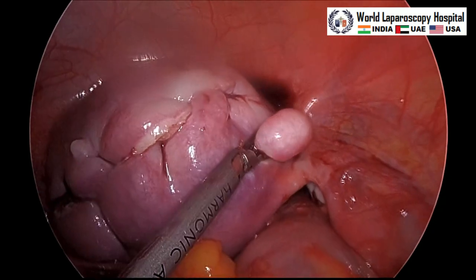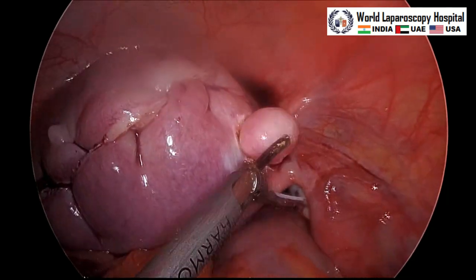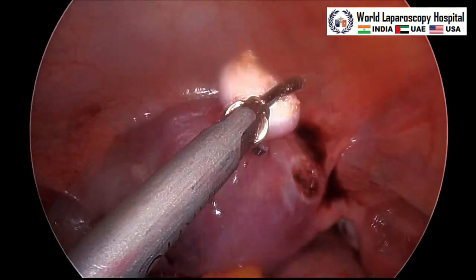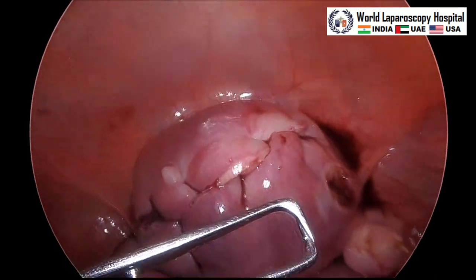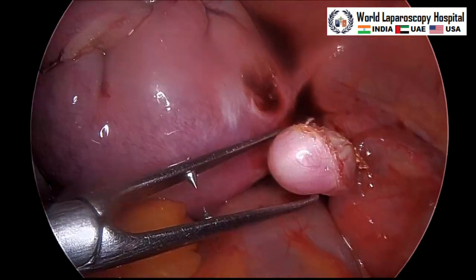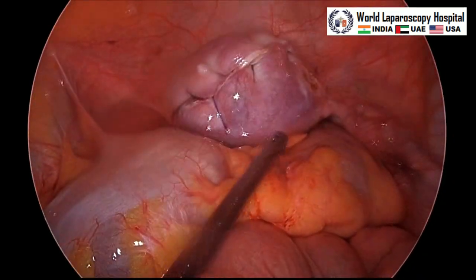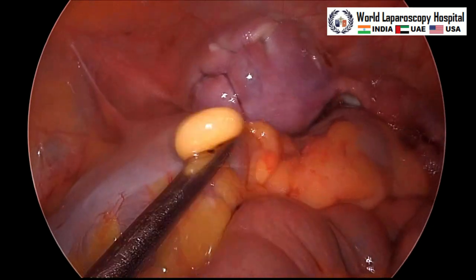There is no bleeding, this small myoma also will be removed. This is the tenaculum of the morcellator, and it is out. Then a little suction irrigation, just to clean and inspect, and in the cul-de-sac, if any blood has collected it should be sucked out.